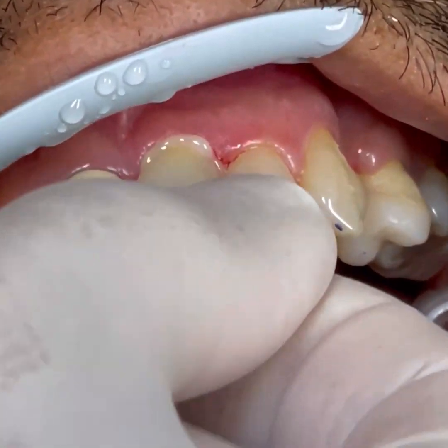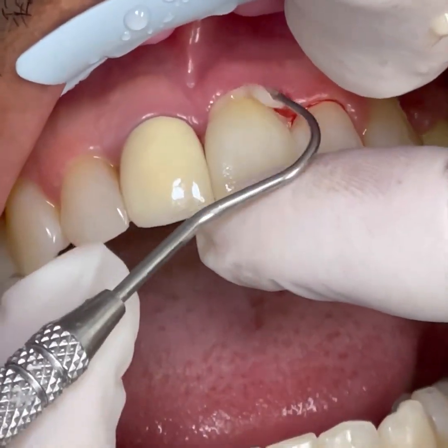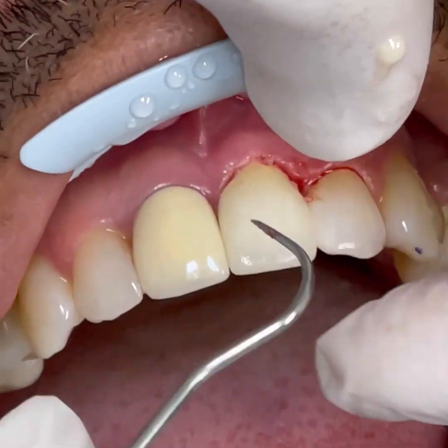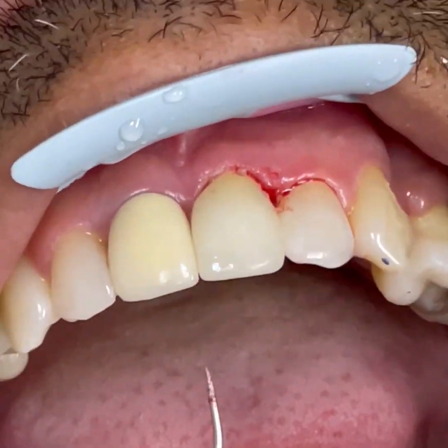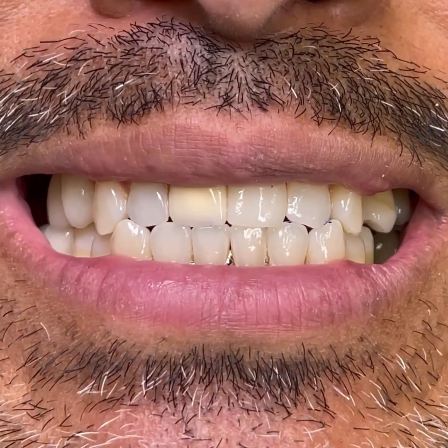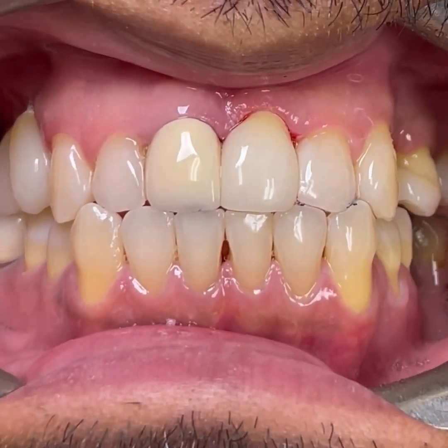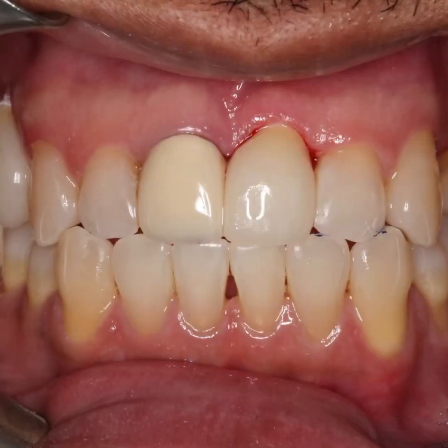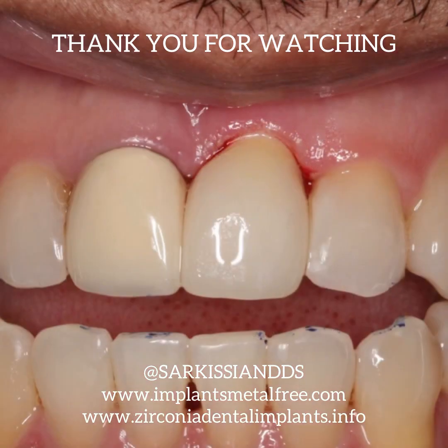Normally you would adjust the contact on the crown itself. The crown is cemented using any dual-cure composite-based cement — I personally use Panavia SA; Panavia V5 is an excellent choice. You can use anything you want, but what is absolutely imperative is to remove the cement without dislodging the crown. After spot-curing the buccal and lingual aspects, you gently peel off the gelled phase of the cement, cure a little more, then remove the rest. After the final cure you may go in and scale out the remaining cement and open the contacts. For posterior crowns it may also be necessary to floss the proximals while holding the crown down.